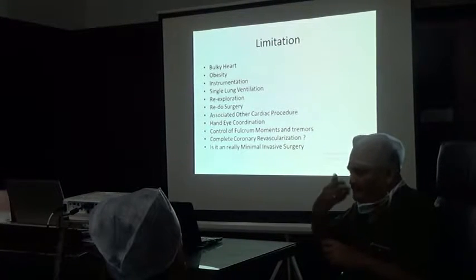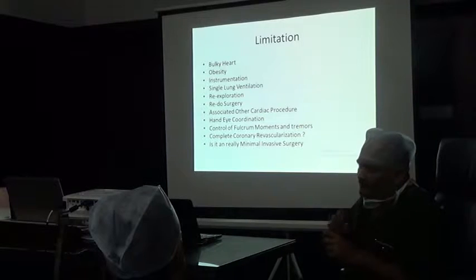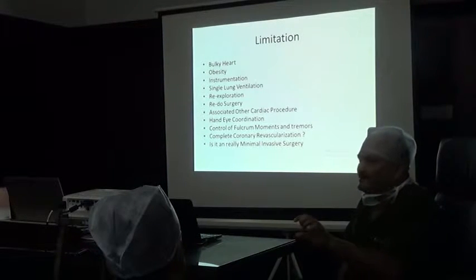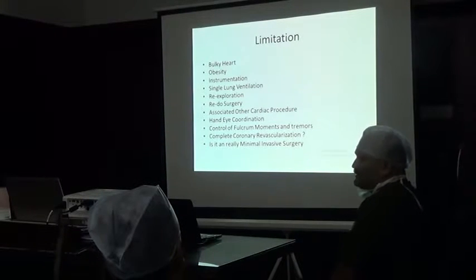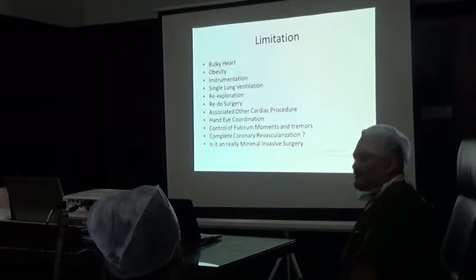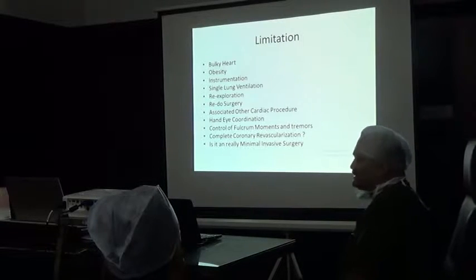You require a bronchoscope, the anesthetist should put an endobronchial tube, and whenever I want, at that time he has to block the left-sided bronchus. So only lung isolation will be there. That is technically a little difficult if the anesthetist is not good. Sometimes you have to take the help of either an ENT surgeon or a pulmonologist to intubate the patient.